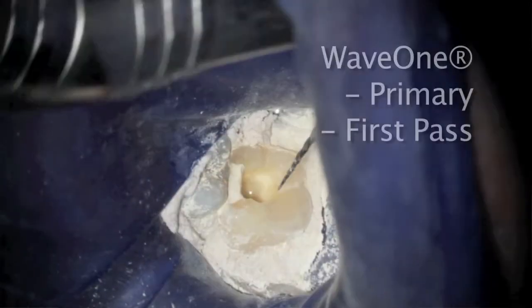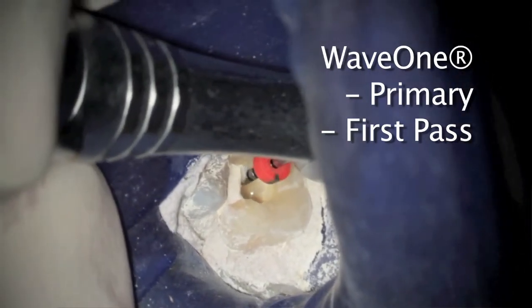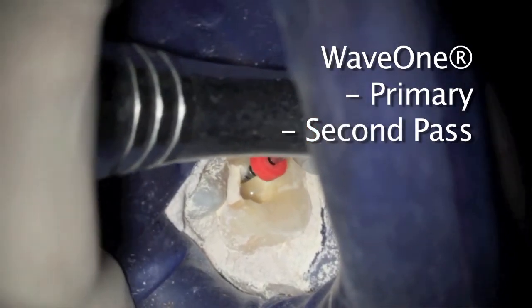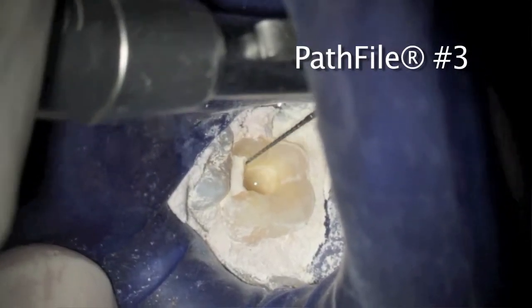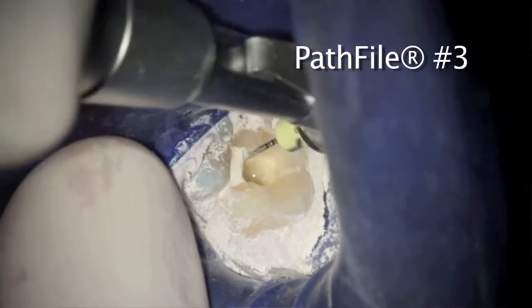Irrigation is critical throughout the procedure. The Wave 1 file is inserted into the canal, advanced apically two or three times, and then removed from the canal and inspected. After removal, wiping, and inspecting, the Wave 1 is introduced back into the canal for a second pass. I can't put enough emphasis on the need for maintaining patency. Here I am taking a number three path file back in the canal to loosen debris created by the Wave 1 reciprocating file.